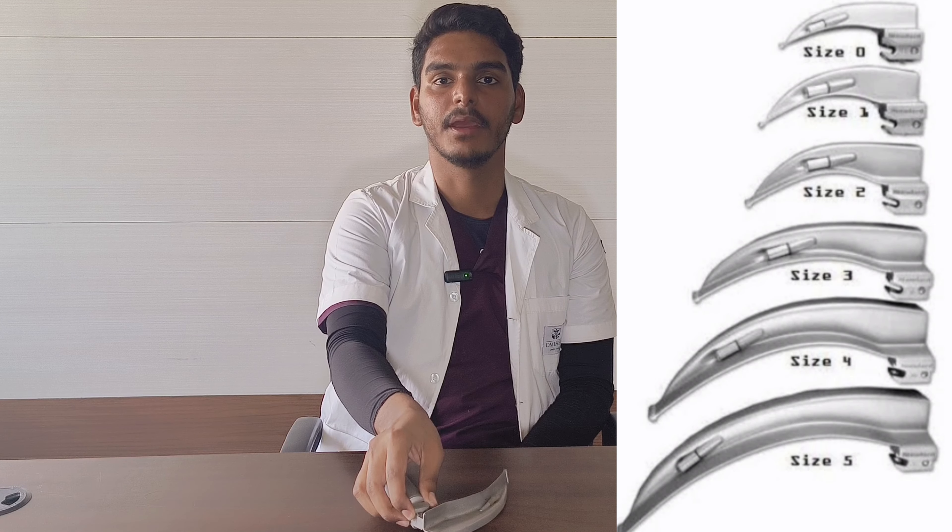Coming to the sizes — the laryngoscope has various sizes, and the blade size varies depending on the type of patient. For infants, we use the zero size Macintosh blade. As you can see here, it is written Mac 3 — this is the third size of the Macintosh blade. Similar to the Macintosh blade, there is the Miller blade, which also comes in varied sizes.